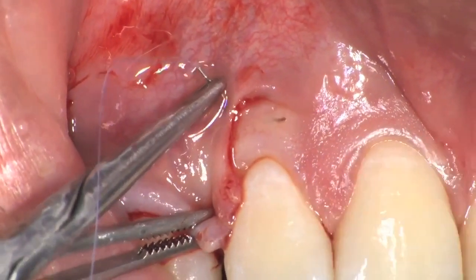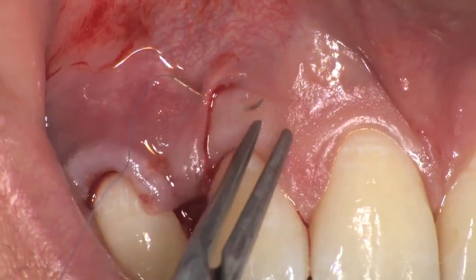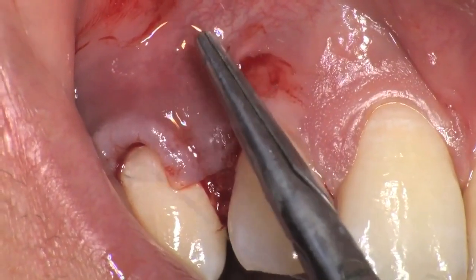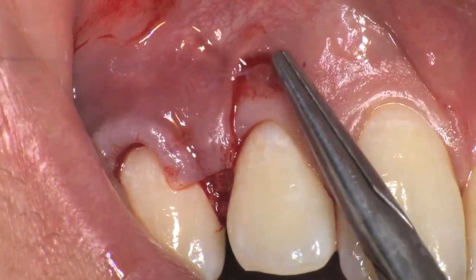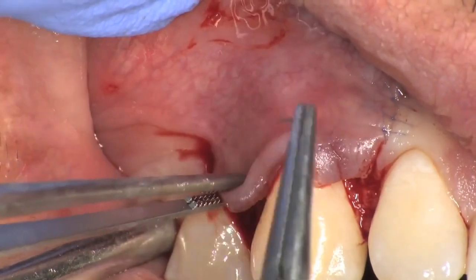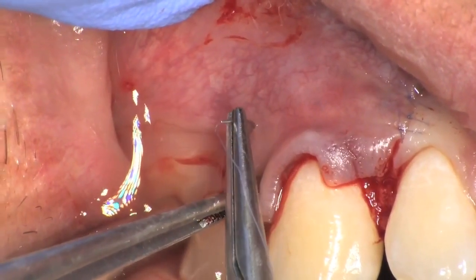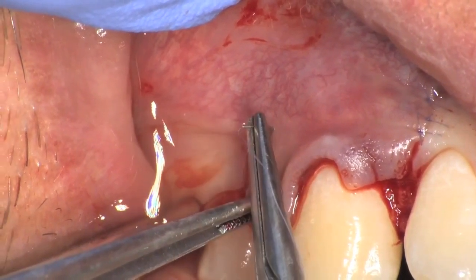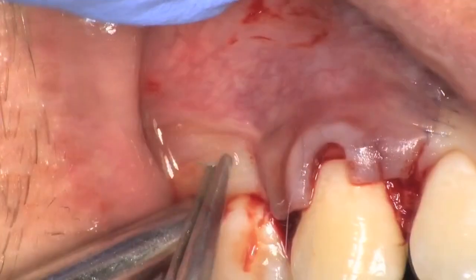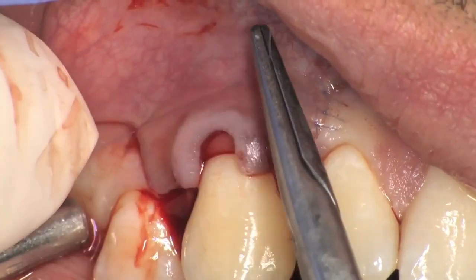The first suture of the flap is along the mesial vertical releasing incision. With anatomical tweezers, the surgical papilla is held above the anatomic papillae and a series of single interrupted sutures are made along the vertical releasing incision with 7-0 PGA sutures. The second suture of the flap is along the distal vertical releasing incision, always starting from the most apical extension of the vertical releasing incision in the coronal direction. All knots are blocked along the vertical releasing incision to ensure tight adaptation.